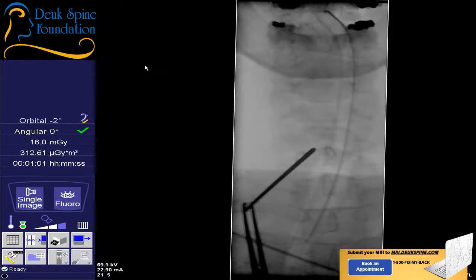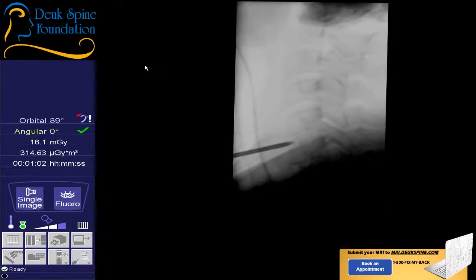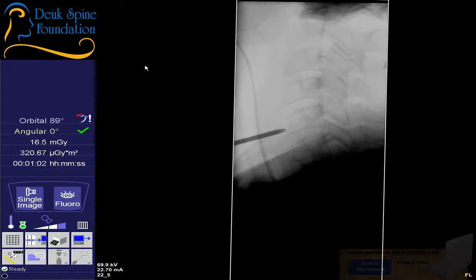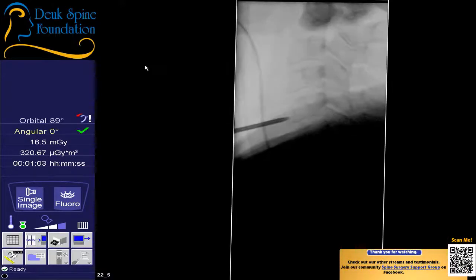All right, I'm off to my side a little bit, so I feel like I went back in the old hole. Shot. And lateral, go. I think I'm back in the old hole at 5-6. Almost done. Yes, I am. So just hang on, guys, and we're almost done. Come out. Yes. Shot. All right, let everybody relax slowly, slowly, slowly. And shot. Yes. Everybody relaxed. Shot.